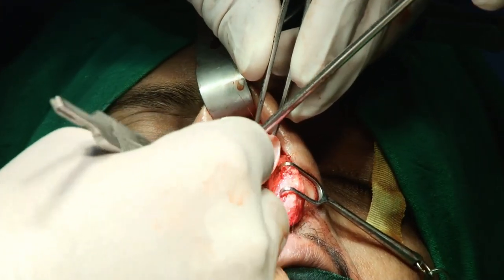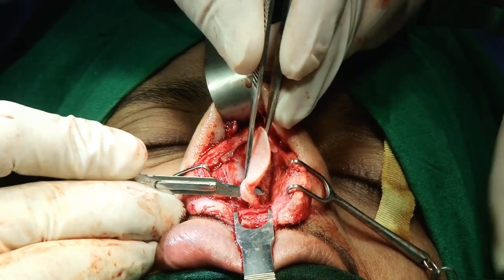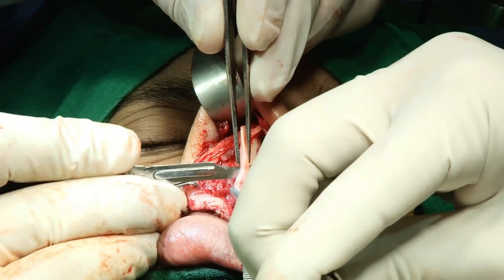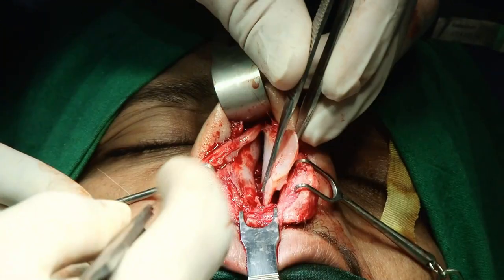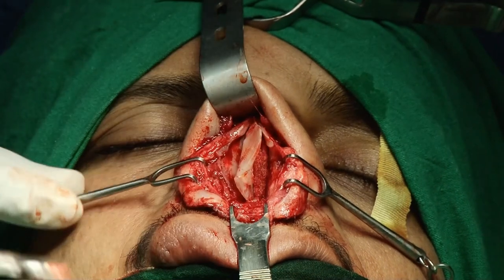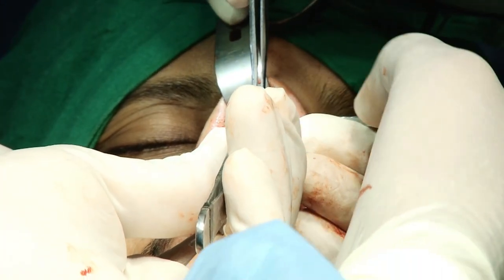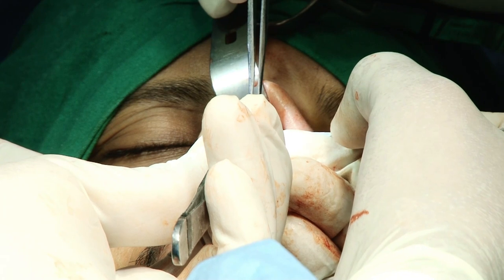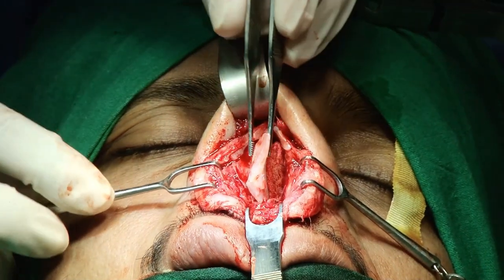How is the posterior part of the septum? Yeah, the posterior part of the septum is deviated on the right side. So first I trim this excess part of the caudal part of the septum before I create my L-strut. First I excise this excess part and then I have a look again. Yes. Now the excess part of this dorsum also has to be excised. Yes. So it should be incremental, not like one shot completely.